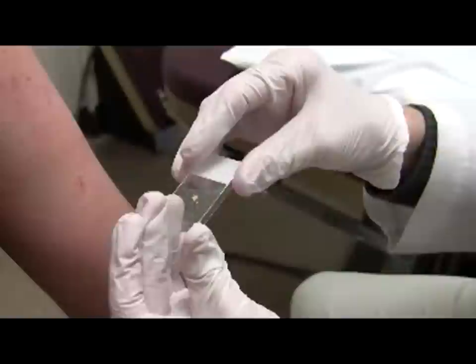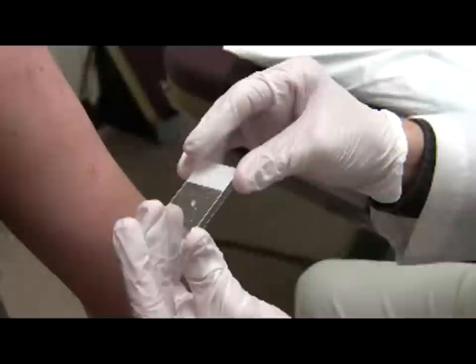If taking a specimen from an oncomycotic nail, use a curette to scrape subungal nail debris onto a slide. Use KOH 20% for nail preparations.